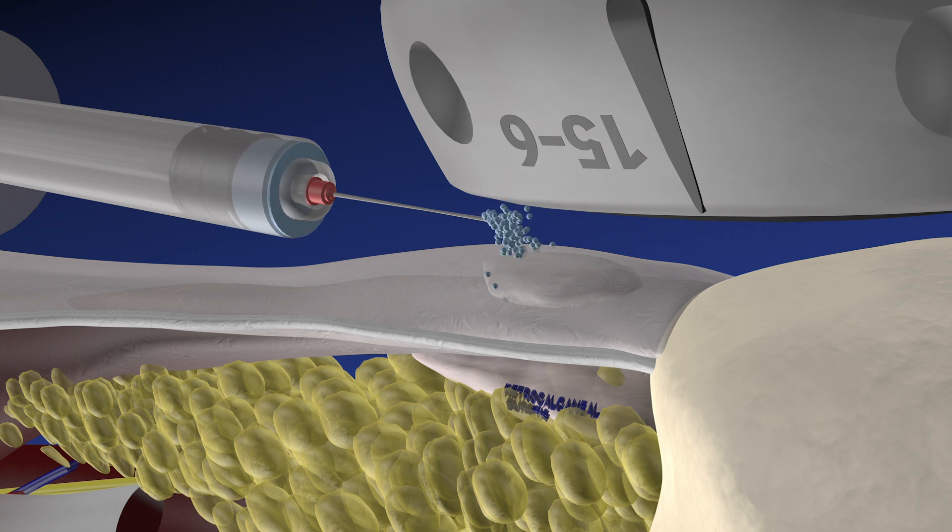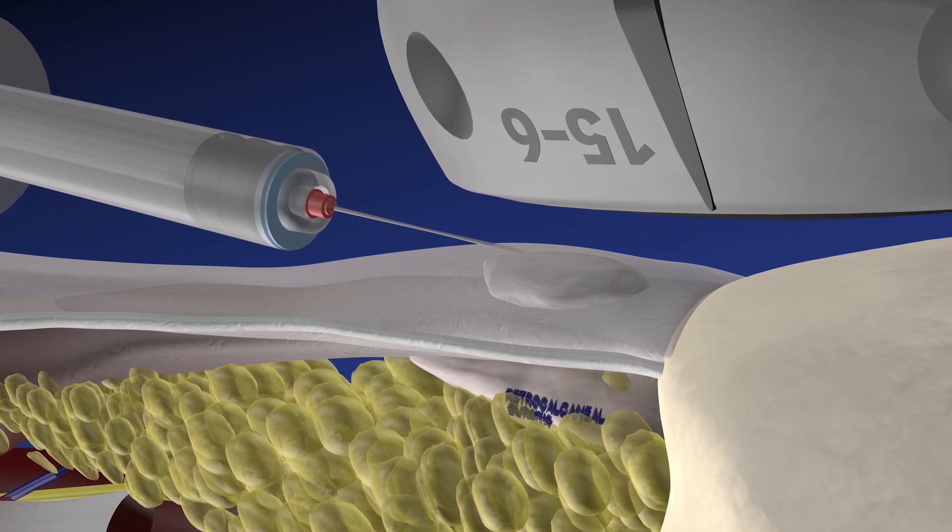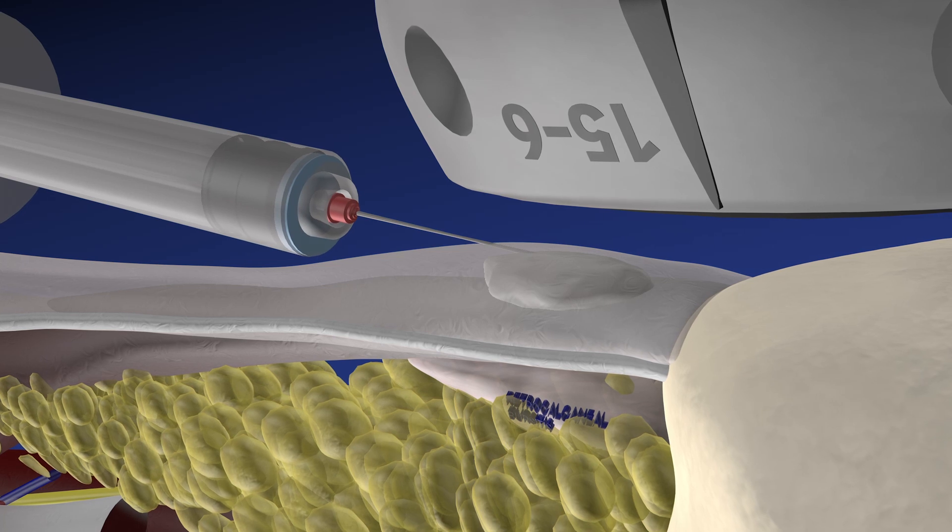Here we are injecting lidocaine superficial to the tendon in order to make this procedure comfortable for the patient. We try to avoid injecting lidocaine within the substance of the tendon itself, as lidocaine and similar drugs may inhibit fibroblast function.